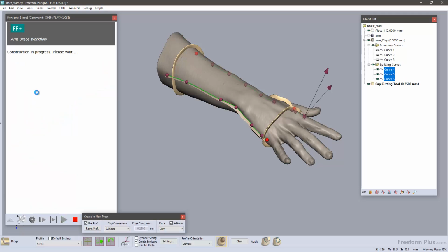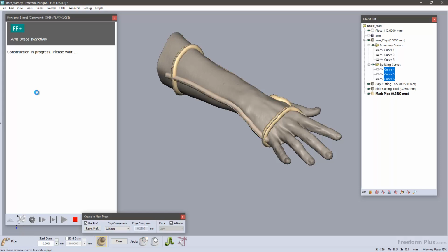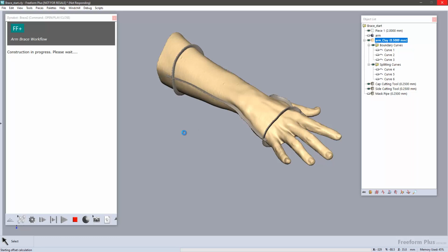Those are being created, as well as a tool for smoothing the area of the edge of the brace. And once all of that is done, it's going to do the offset from the initial scan data. So right now you can see starting offset calculation. This takes about a minute or so on my laptop, so we just have to be patient, and the Dynabot does tell us construction in progress, so we have some indication that something's going on.